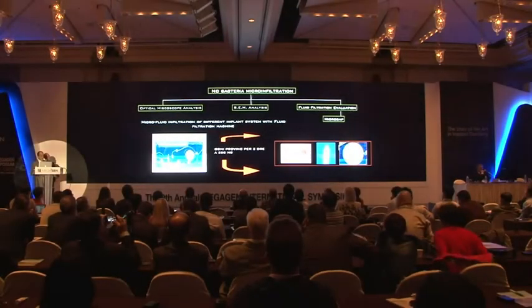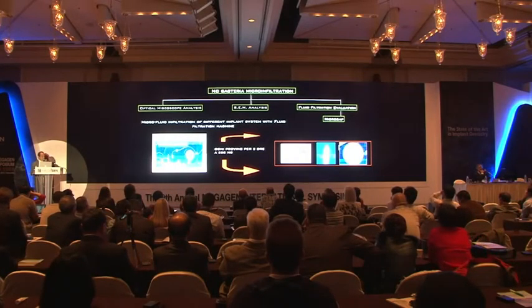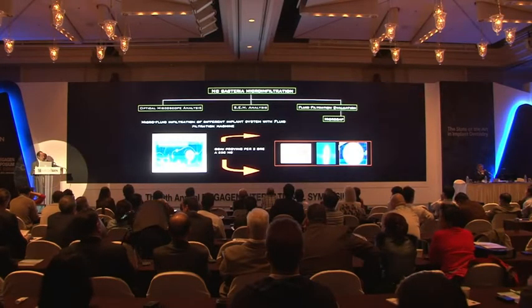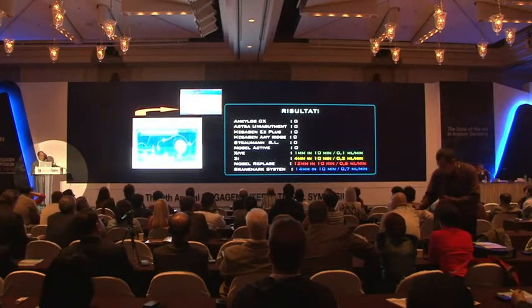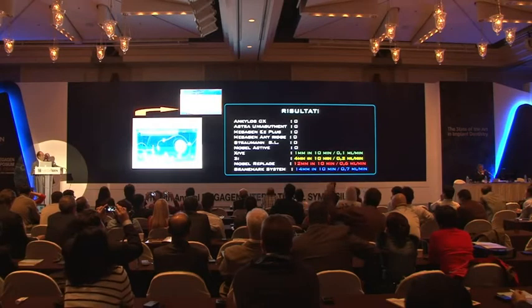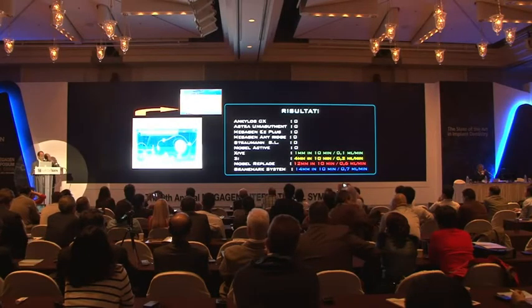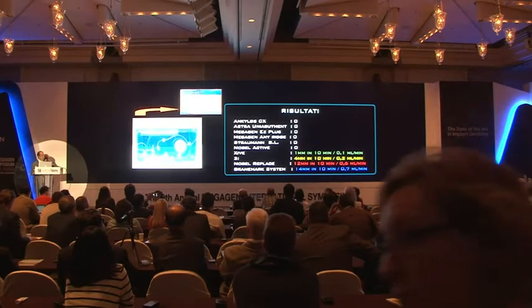The third exam that we did to check the implant abutment connection precision is called fluid filtration. It consists of putting the implant abutment system under pressure and checking whether we have a fluid loss from the connection. The implant and abutment sample were joined together with resin, and afterward we took off the screw to insert the fluid. The result was that all the conical connections didn't have fluid loss. Instead, the flat-to-flat connections had a fluid loss that went from 1 mm for Xi to 14 mm for Brånemark. The fact that the conical connections didn't have fluid loss proves that every titanium cone, even if, as we saw with the SEM, there is a small gap at the top, has some points inside where implant and abutment seal.